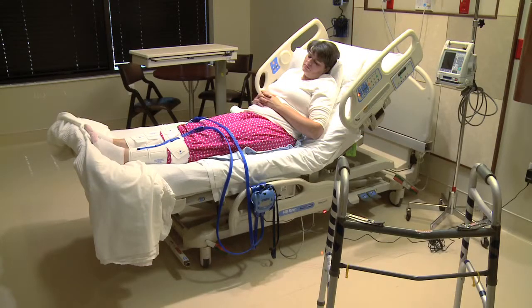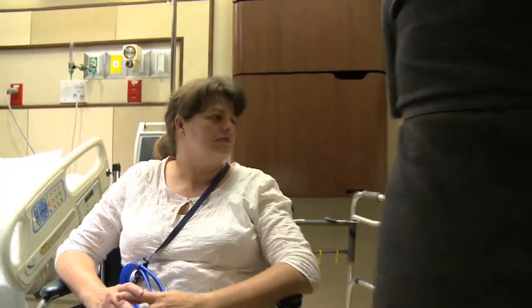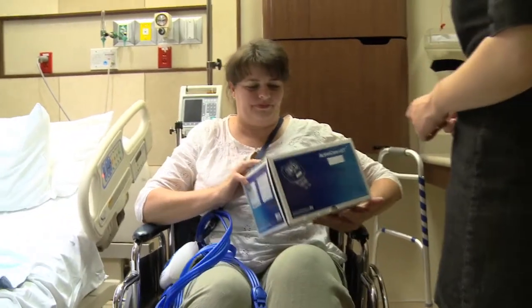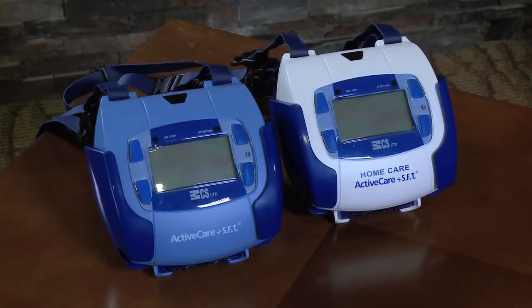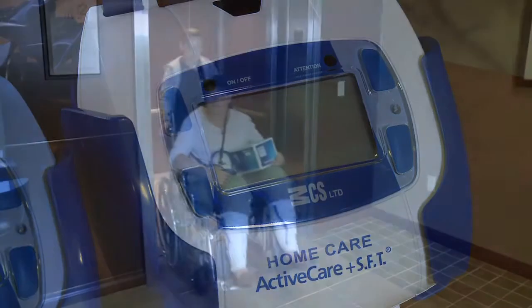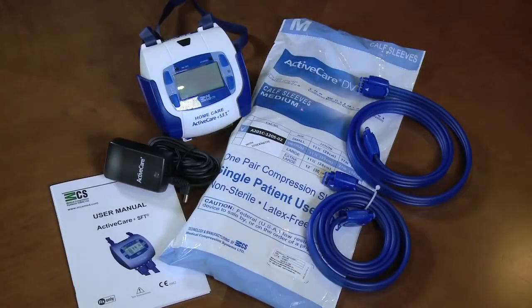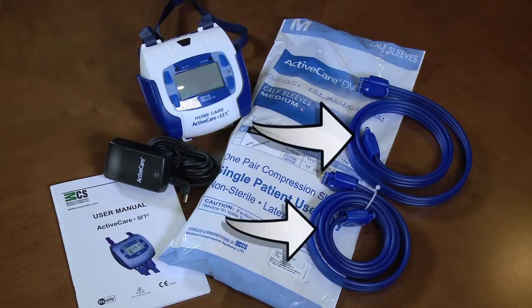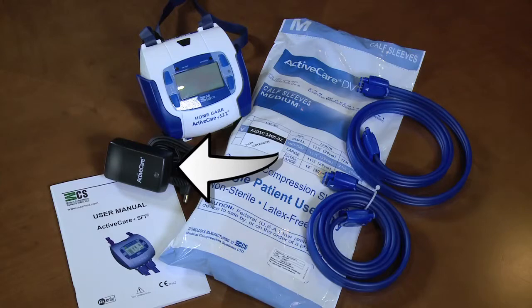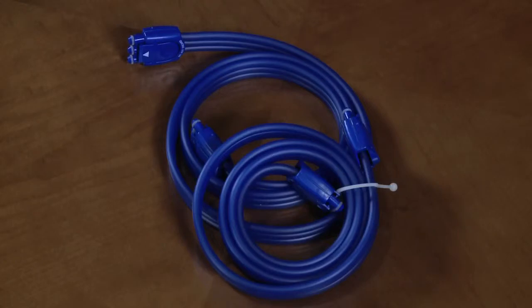Using Active Care Plus SFT at home: you should have some familiarity with the device, as you have been wearing it while in the hospital. Prior to being discharged, you'll receive a rental unit — either the same unit you wore in the hospital or one just like it. You will take this home and use it for the duration of your therapy as prescribed by your doctor. Once therapy is complete, the rental system must be returned. Your rental system includes a set of sleeves, two tubes, and one charger. All components except the sleeves must be returned at the end of your treatment.